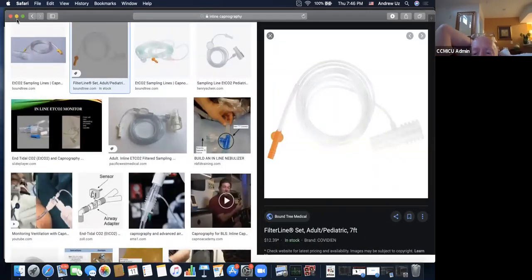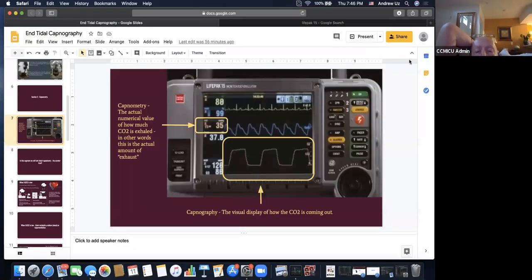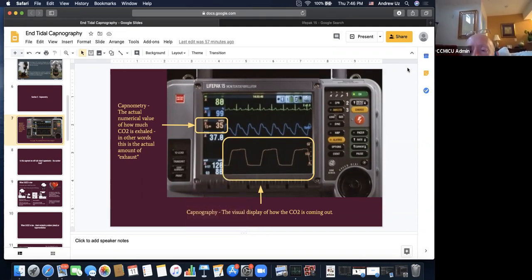The other thing I would add is that the two most common BLS uses, and you could extend it to three, are somebody with asthma, or you're looking for a shark fin. Say somebody has a history of asthma, or you've got a child with trouble breathing, and you decide you can still give them oxygen, either through a non-rebreather.